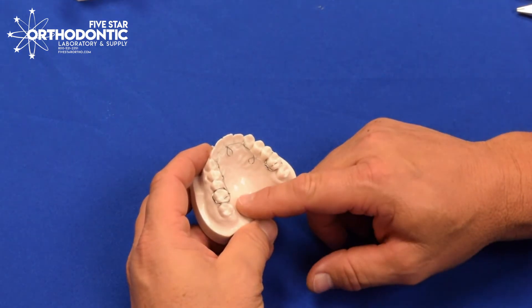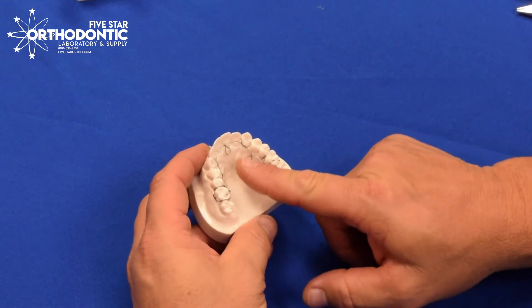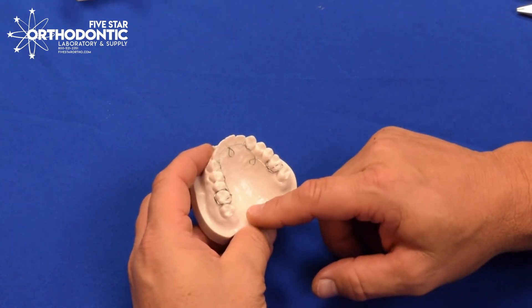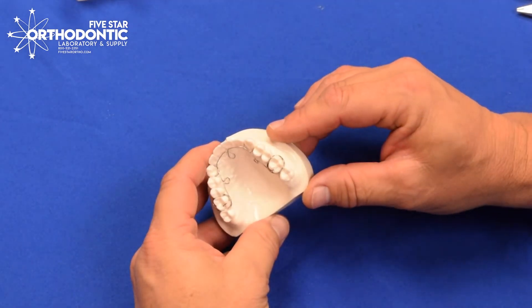Ideally, the only loop that you usually adjust is the anterior loop. The other loops are more like shock absorbers and give you a little bit of flexibility as you place the appliance.